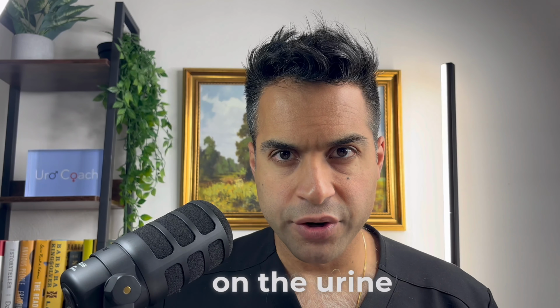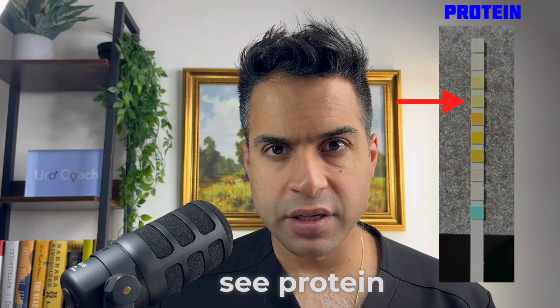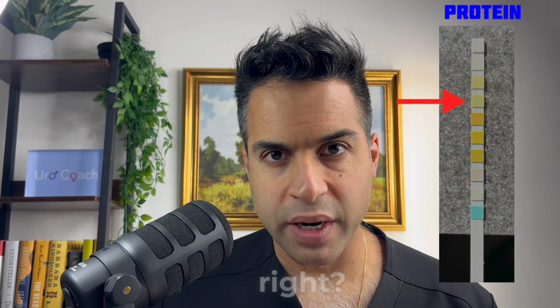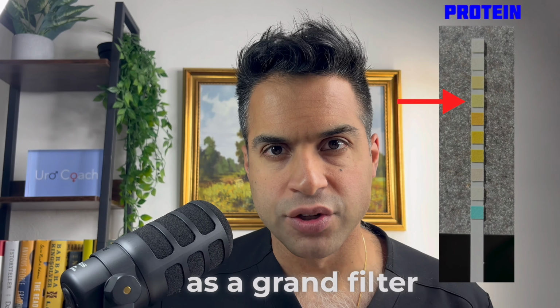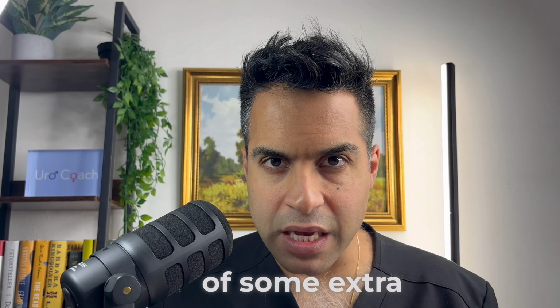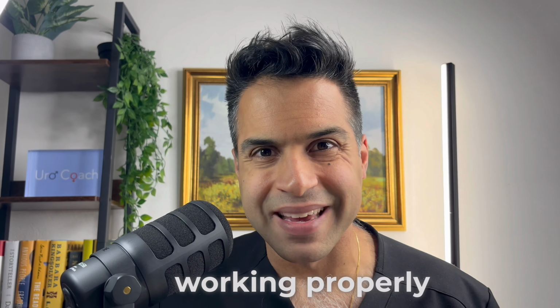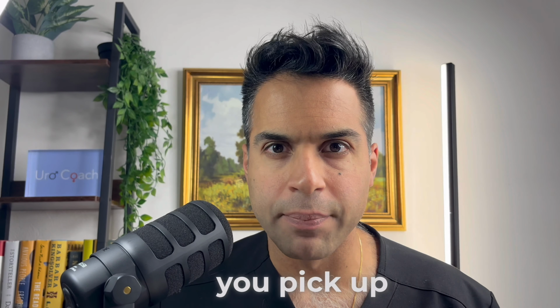Okay, the next one on the urine dipstick is protein. Look at the diagram here. So when you see protein on the urine dipstick, the first thing that we think of is kidney problems, right? Kidney dysfunction. If you think about the kidney as a grand filter in the body, if there's kind of some extra holes in the kidney or the filter isn't working properly, then protein will spill into the urine, and that's what you pick up on a urine dipstick.